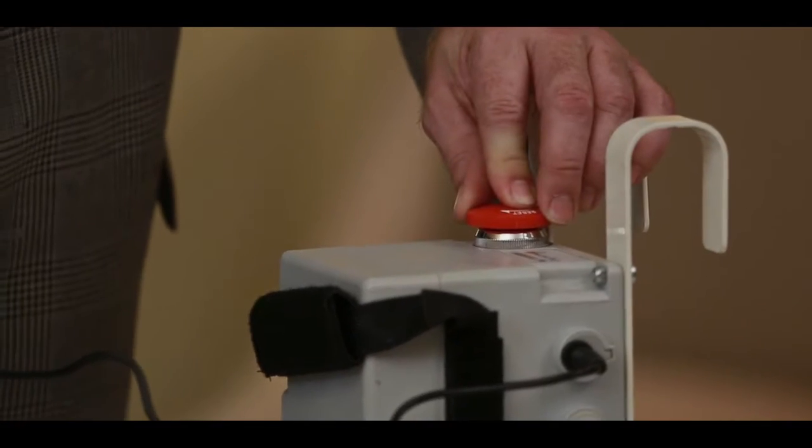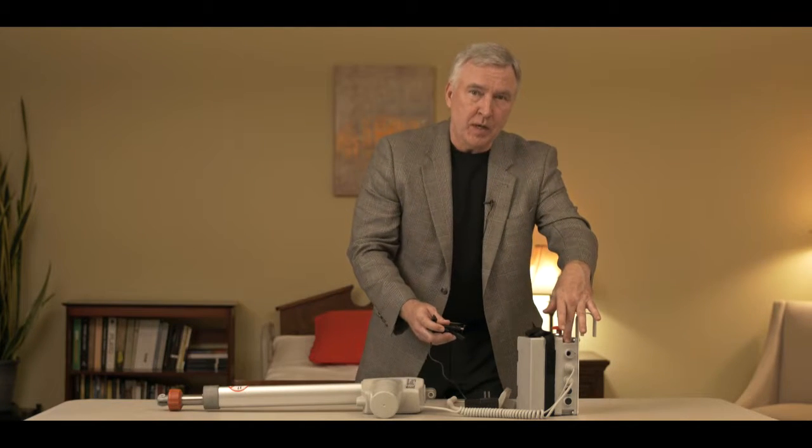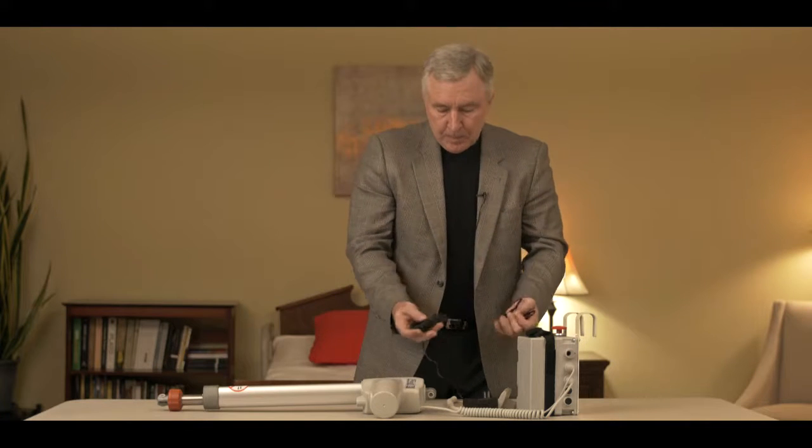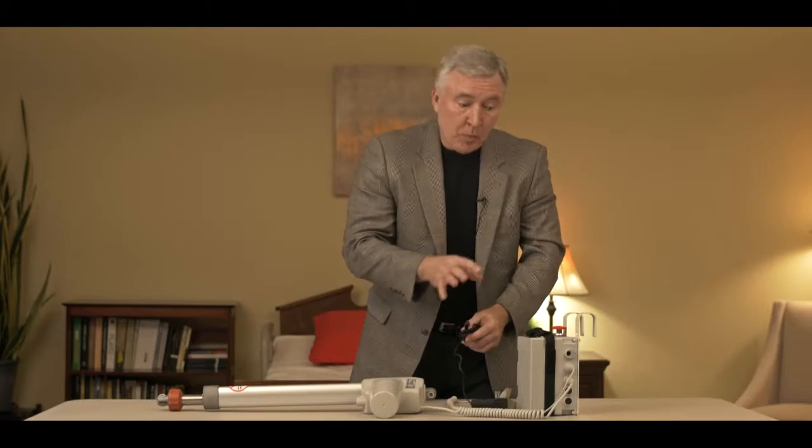Also, don't forget — if the emergency stop button is pressed in, the lift won't charge. Or lastly, the actual PCB inside of the unit could be bad. The best way to isolate the problem is to first plug the charger directly into the port and see if the lights show up. If they don't, then you probably have a bad PCB in the unit.